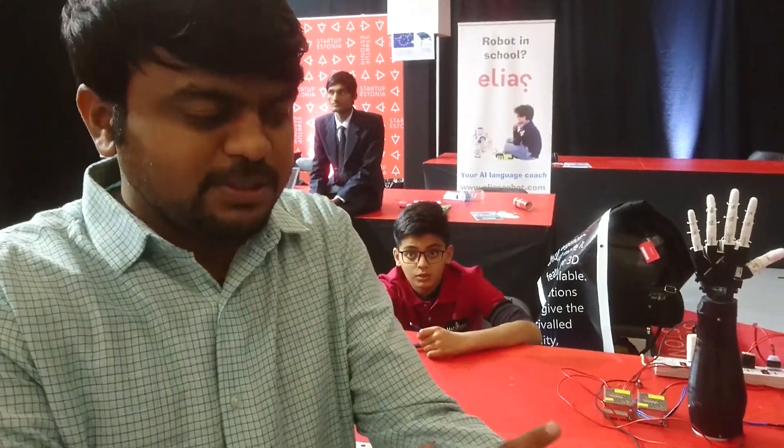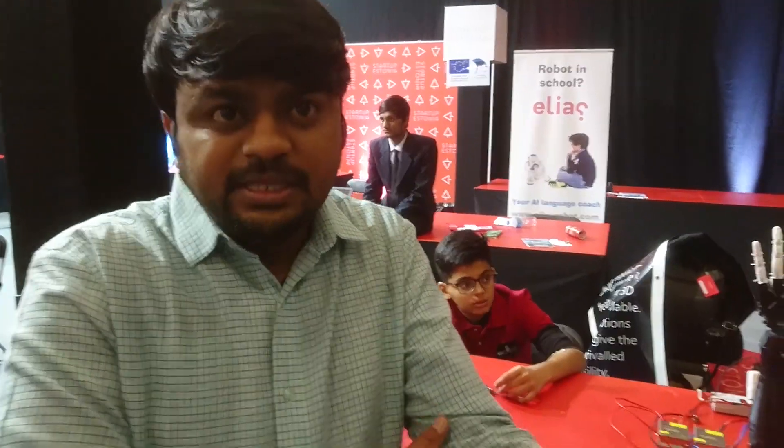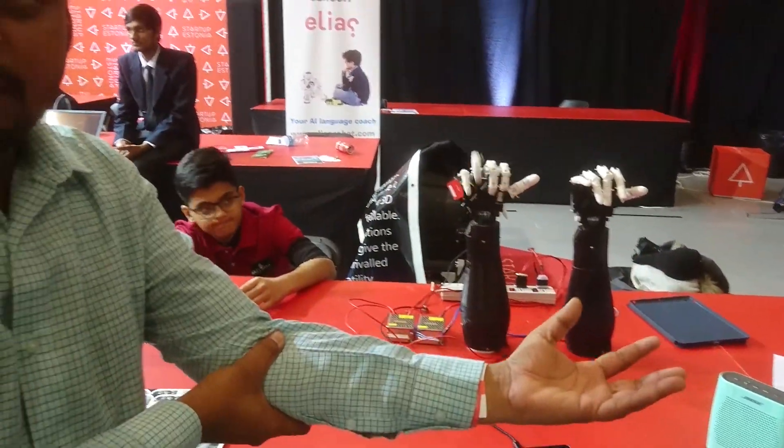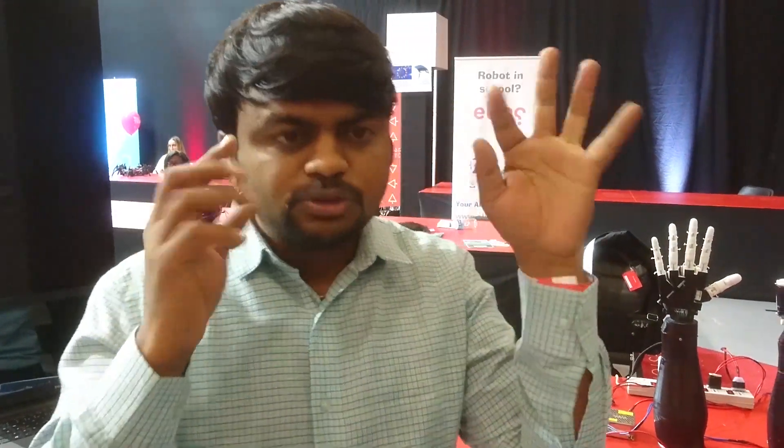Suppose a person's hand is cut — if we give them this hand, you just have to connect it and interface some brain sensors, then calibrate it. Without surgery, it is possible. You just have to think about your fingers.